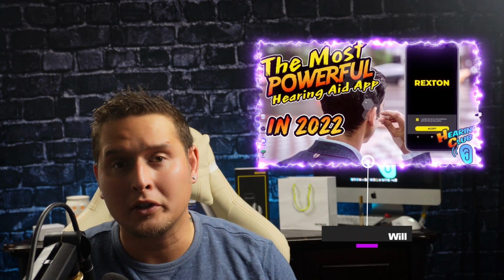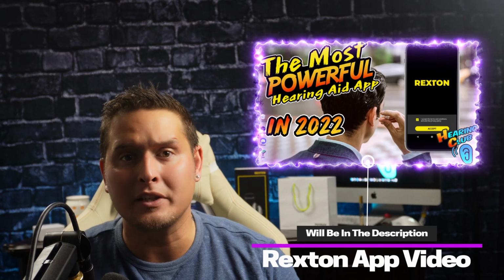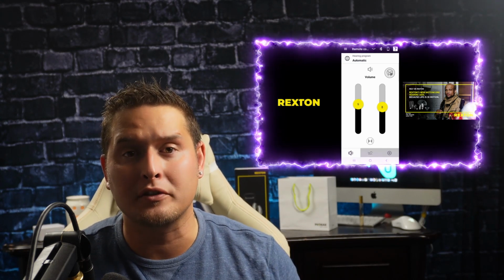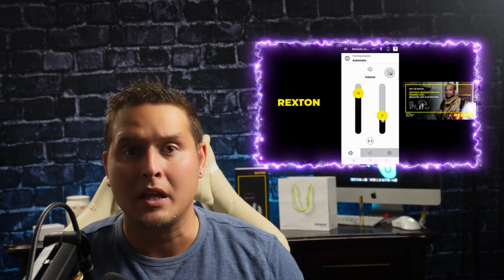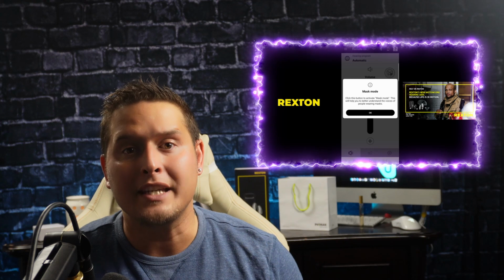Now, if you want to check out a really amazing app, I have a video about the Rexton hearing aid app, and it is absolutely amazing and gives you all kinds of control over your hearing aids. You can make adjustments. With the Rexton app, you can even tell your hearing aids that your own voice is coming in too loud and it's bothering you, and the app will actually reduce the volume of your own voice, because for a lot of new hearing aid users, that is a big problem and something that's very hard to get over. Again, I have videos on all this stuff. I don't want to take up too much time on this video, but I just wanted to show you guys and explain how you can use the app that you can download for your hearing aids to change programs.